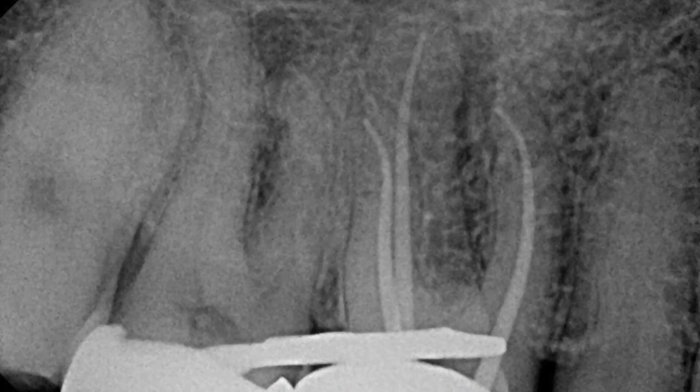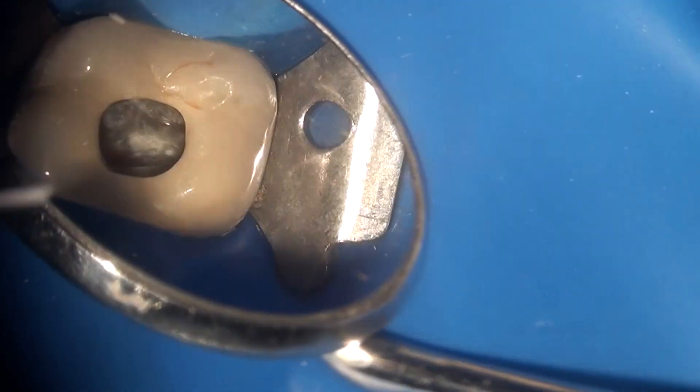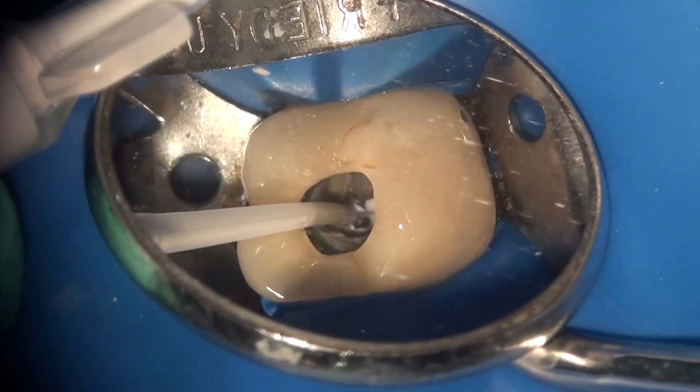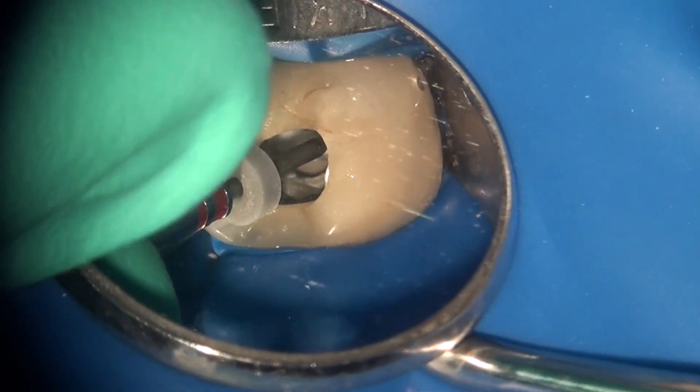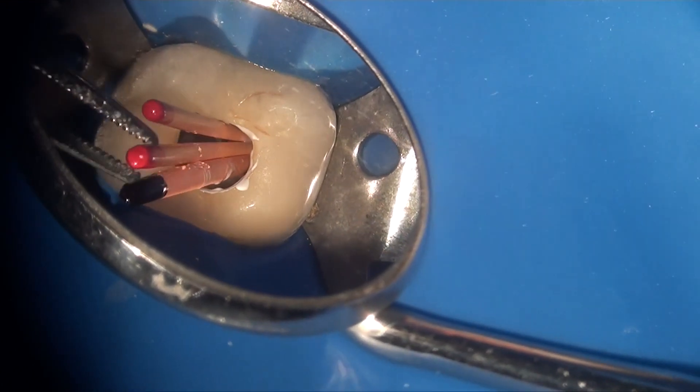Matching bioceramic coated cones were then used and a cone fit radiograph was taken to confirm. Note that you can use one size smaller master cones than your master file if you have a tight canal. Since the actual seal is provided by the bioceramic filler, it's very important to leave room for venting of the bioceramic around the cone to avoid a vapor lock. The palatal root was very wide and appeared ribbon-shaped. BC sealer was placed in the coronal half of each canal and pushed to the apex using a file, and the BC cones were coated with bioceramic sealer, seated, and confirmed to have reached full length.